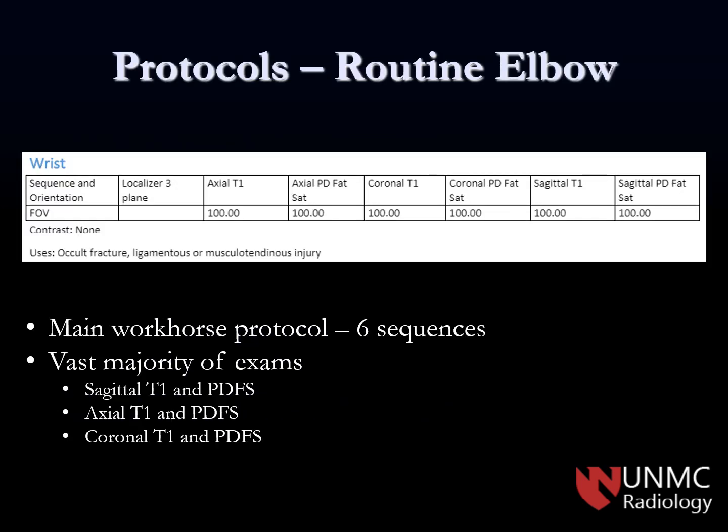The routine elbow MRI has six sequences: axial, coronal, and sagittal T1 and PD fat-saturated images. It's a simple, fairly straightforward protocol used for the vast majority of all studies — occult fractures, ligamentous and musculotendinous injury, basically the spectrum of routine elbow pathology.